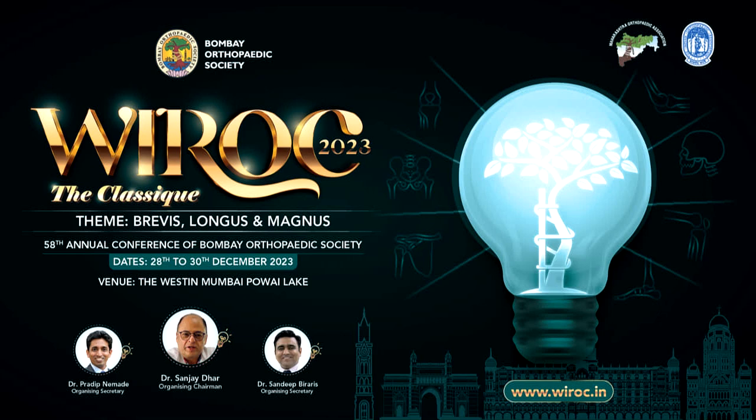Yes, so the harm, as I have seen in my cases, is 25% screw removal because of screw cut-through. If there is a mild collapse also, I've seen a couple of patients where I've removed the screws. So that is the only thing, hardware with more chances of complication. In my practice, the main one is the calcar screw. If I'm getting a calcar screw and then the 2 divergent screws, they are the main 3 screws I'm focusing on. I might add additional 2 convergent screws if I feel that the bone quality is not that good. But 5 is the limit for me. The most important are the calcar and the 2 divergent screws which hold the spread of the head.